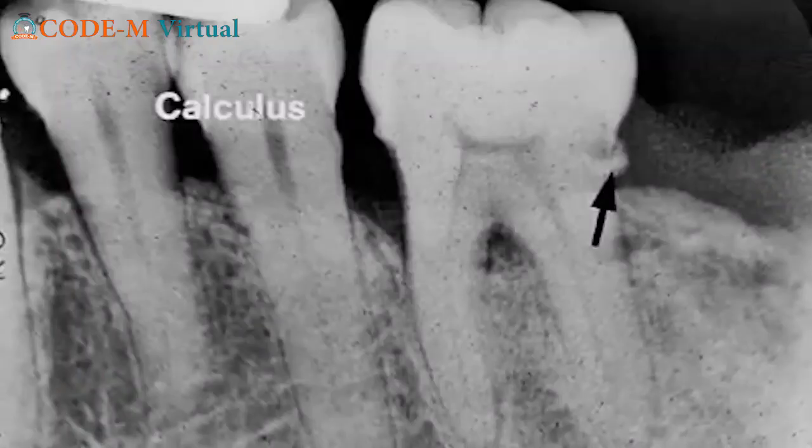So this is an X-ray showing some calculus on the molar on the distal side, and the arrow is showing you the calculus, and we should know that calculus appears radiopaque on the dental X-ray. It depends on the density of the calculus how radiopaque it can appear on an X-ray.